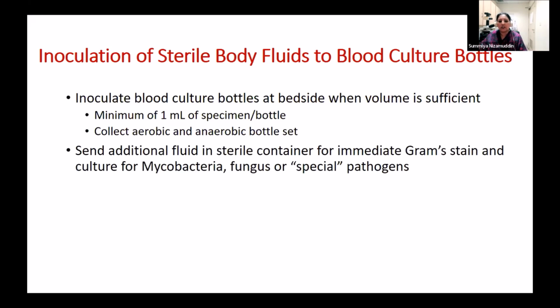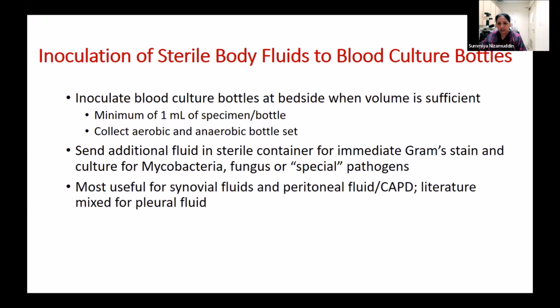If you're suspecting TB, or fungus, or any other special pathogens, then it's always better to send the sample in a sterile container rather than in blood culture bottles, because they will need to be handled differently or separately.